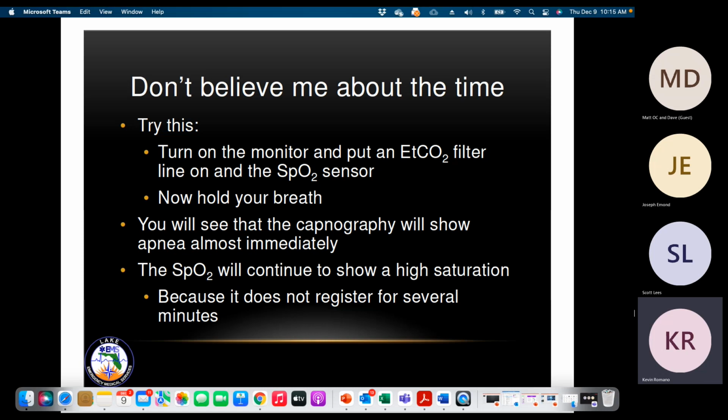That's why it's so important for us to get high flow oxygen on patients that are having STEMIs to help oxygenate the system, right? But also in turn, we make sure we're oxygenating the patients that are not breathing effectively, because eventually something's got to give, right? That's why it's so important to oxygenate. And this happens a lot, I've seen this on BLS discharges, where they sit in the airway seat and they don't monitor their patient other than SpO2 and vitals or blood pressure. Now, if you set it for every 15 minutes, 15 minutes later, the patient has a blood pressure of 60 over 40 because everything's decompensating because they've gone 15 minutes without breathing.